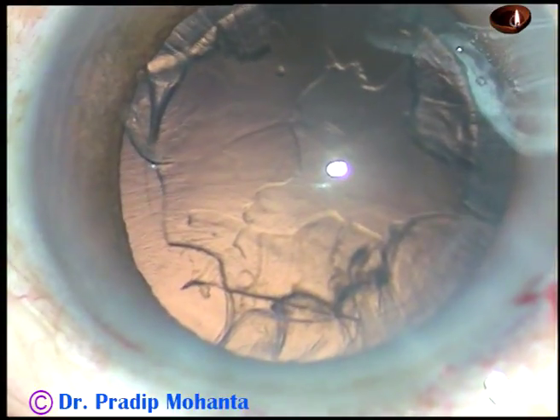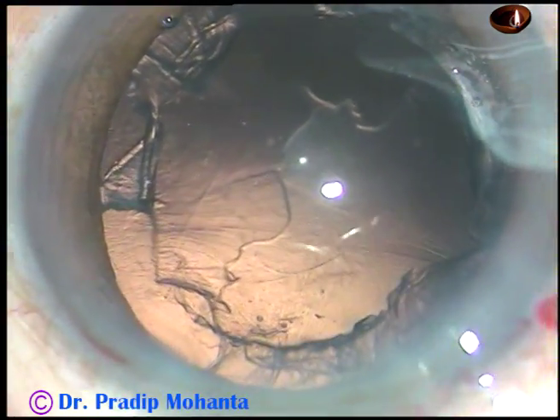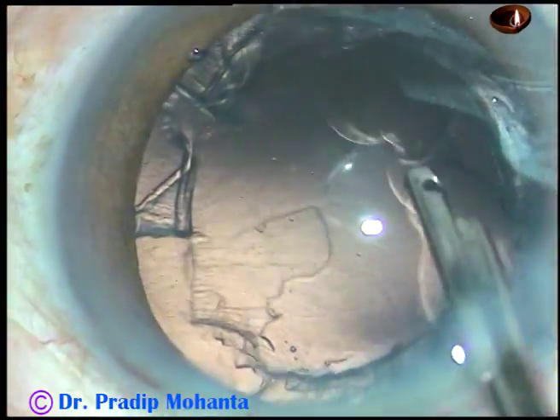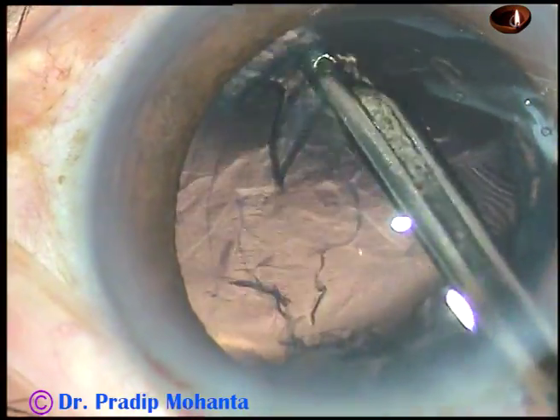This is an unedited video. The machine being used is Oertli Cataract 3. Phaco power used in this case is 50%, flow rate is 45 ml per minute, and vacuum is 450 mmHg.